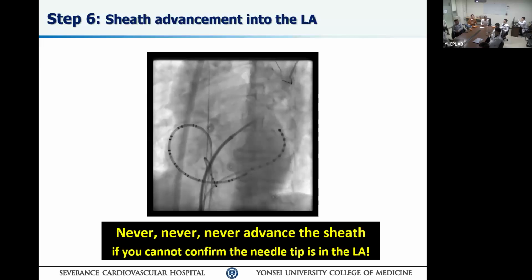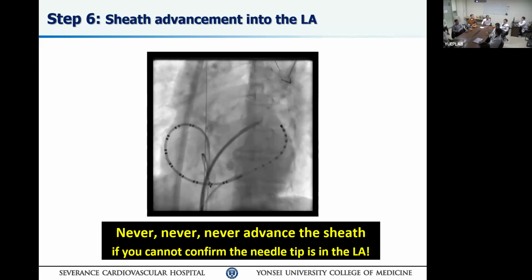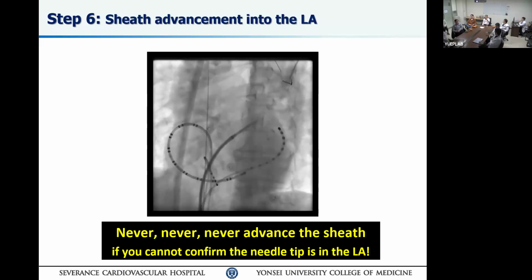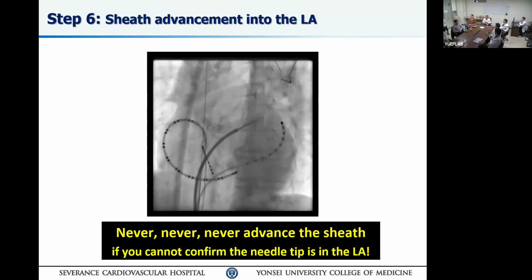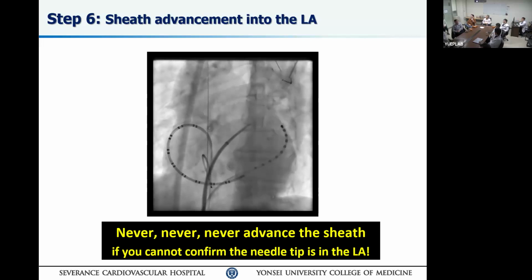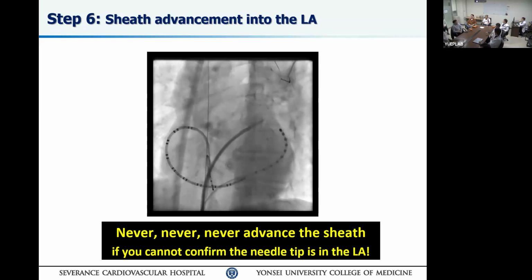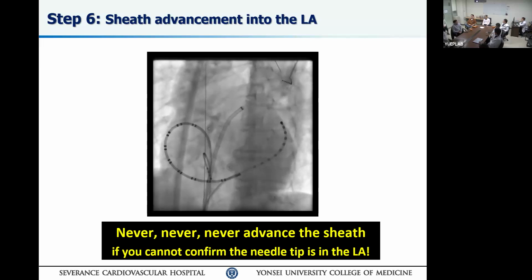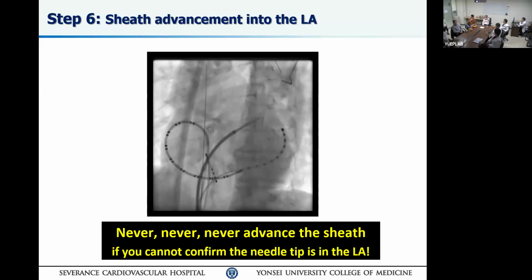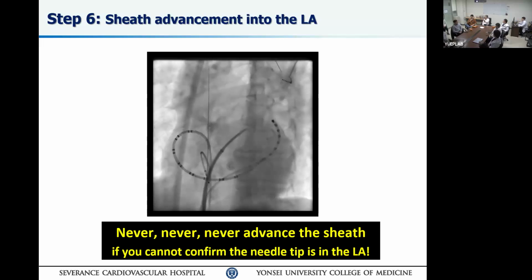So the average long axis of the fossa is 2 centimeters, about a quarter dollar coin size, or slightly smaller. Now, I give you one piece of advice, because you will face one of these patients. The patient has never had a transeptal procedure, and then you look at the intracardiac echo. Patient has a lipomatous septum, a superior process of fat tissue embedded into the margin. You're going to have a 15 millimeter thickness there.